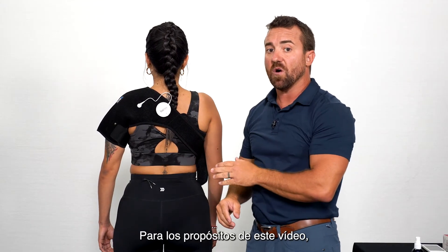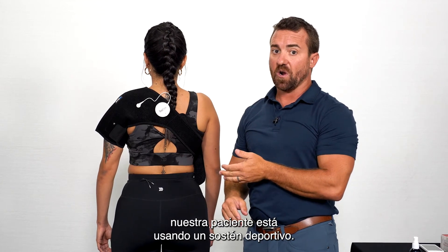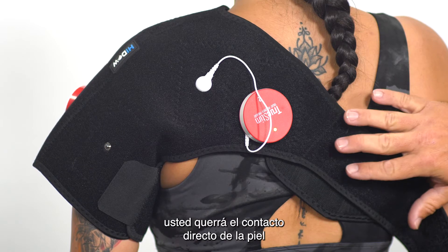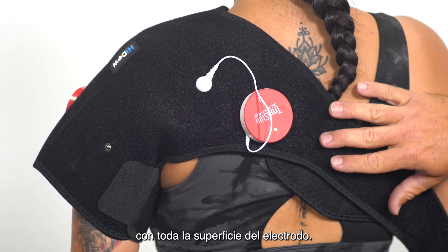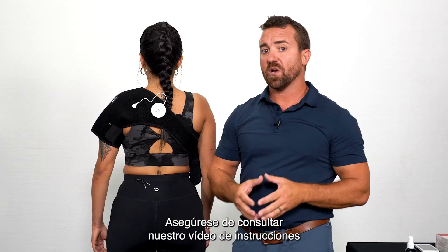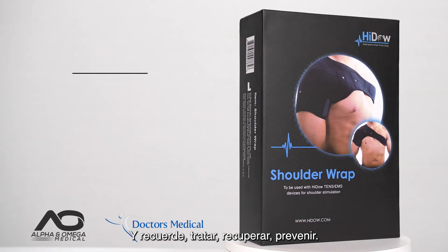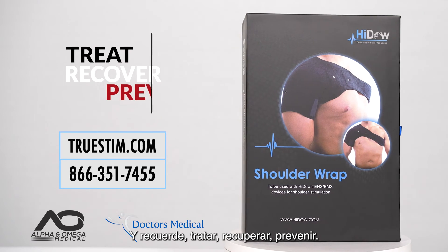For the purposes of this video, our patient is wearing a sports bra. At home, when treating, you will want direct skin contact with all of the electrode surface. Be sure and refer to our full instructional video on the TruStim Wireless EMS system. And remember: treat, recover, prevent.